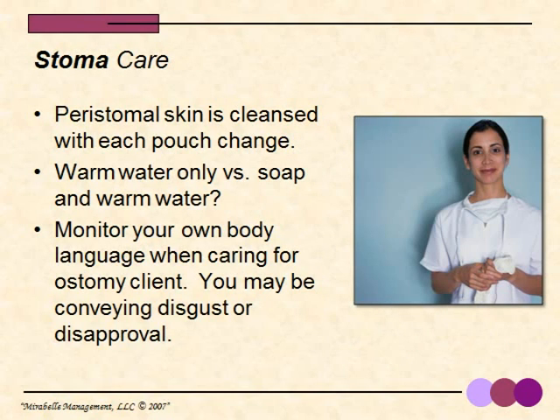As I just mentioned, discharge from any type of stoma is potentially irritating. The peristomal skin should be cleansed with each change of pouch. The Clinical Nursing Skills Manual states that warm water and a mild soap that leaves no residue should be used to cleanse around the stoma.